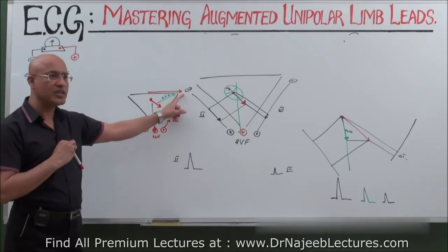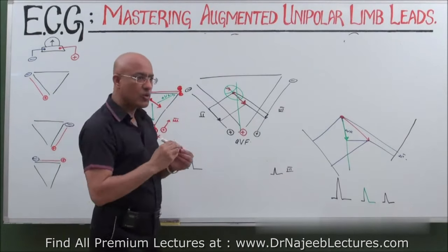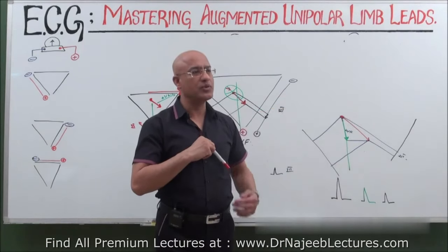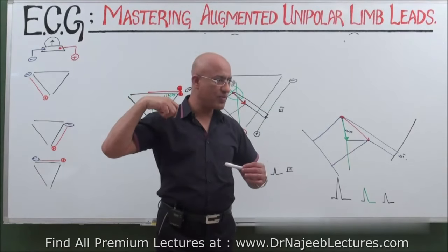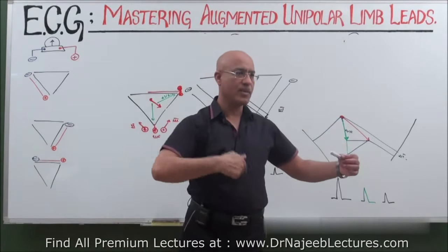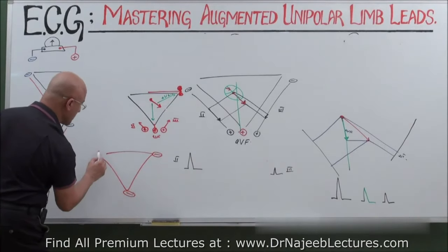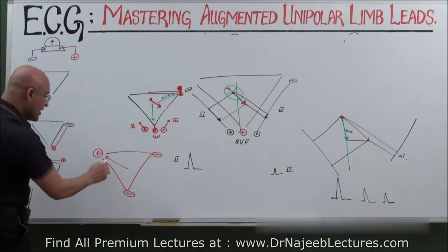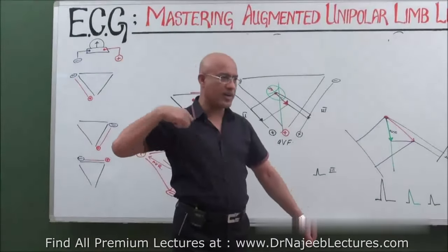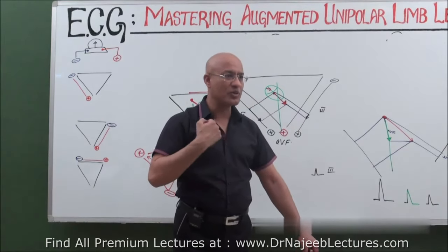And the leftward leads, which are the leads that have a positive electrode on the left side? Lead number 1 and AVL. So lead 1 and AVL will have somewhat similar complexes. But there is a big issue. When you put the positive electrode here, and the other two limbs, left leg and this, negative, you are making which lead? AVR. Look, my friend, I'm talking about if you put negative here and negative here and positive here, what is this lead? AVR. If the electrical axis of the heart is going downward and leftward and the AVR axis is going upward and rightward, are they in the same direction or opposite direction? So here the QRS complex will be reversed because positive charges are moving away.